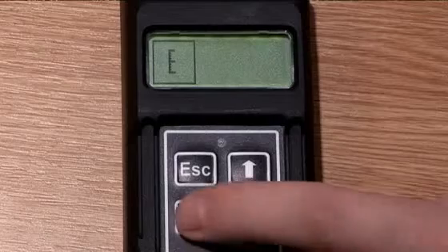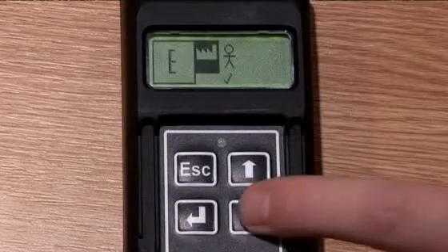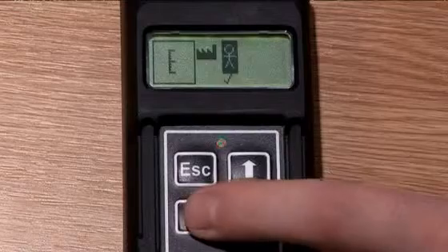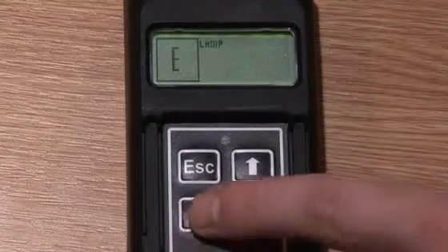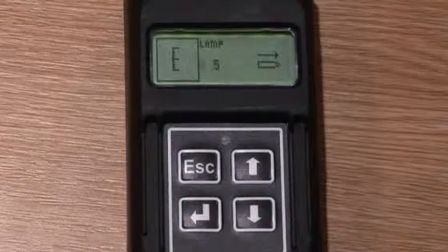A tick will then appear to confirm the selection. Pressing enter allows the user to enter the custom calibration menu. Select the flashing lamp by pressing enter.